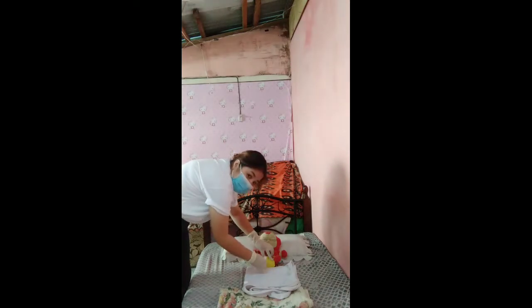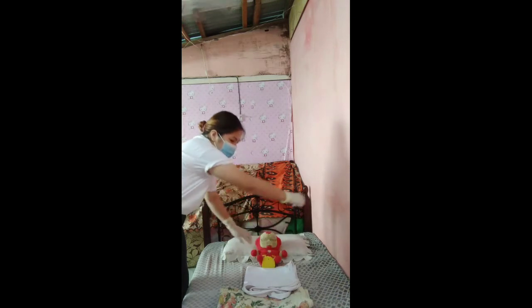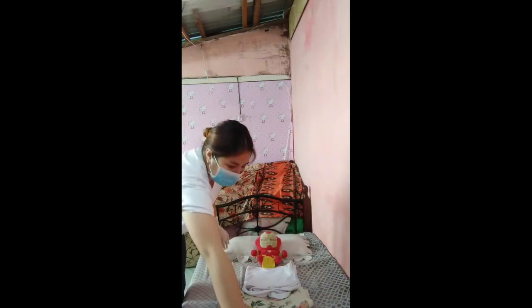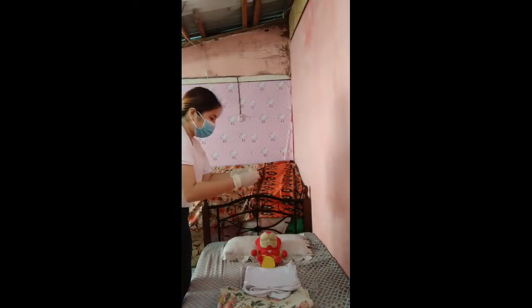Here, the first one is the right side. So here, after wiping, discard and get another alcohol swab.